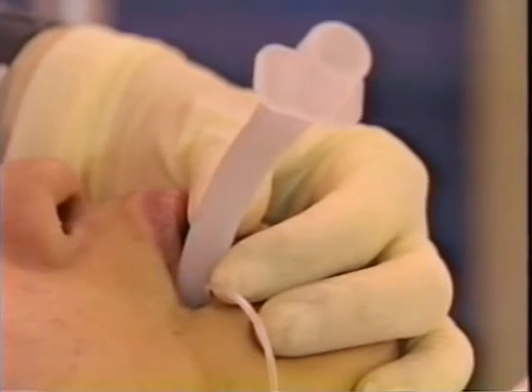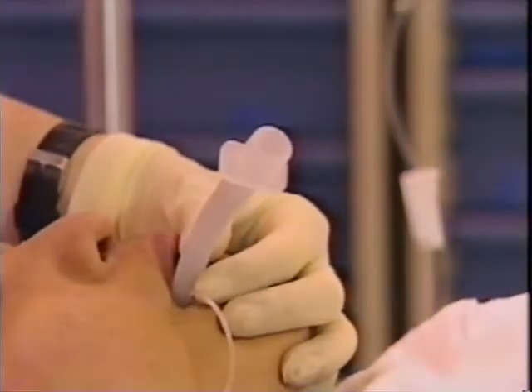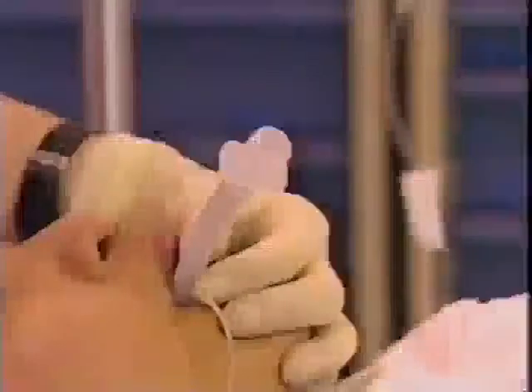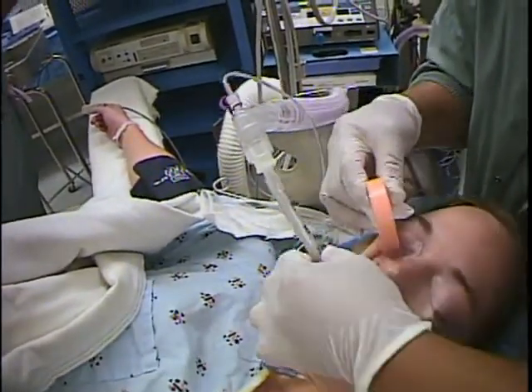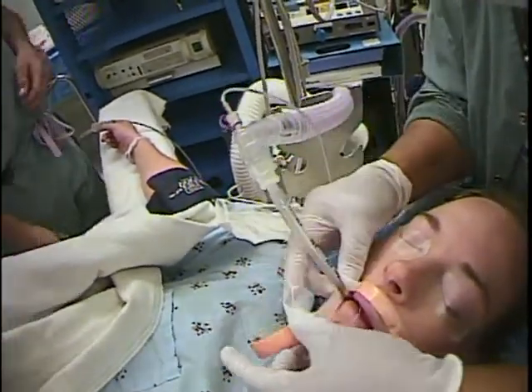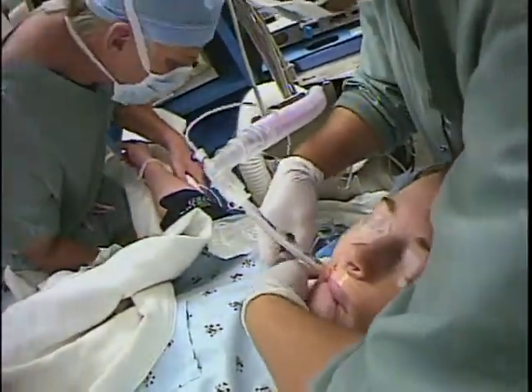After intubation, you need to stabilize the endotracheal tube before taping it, and also every time you move the patient. Hold the tube where it exits from the mouth, resting your hand on the cheek. Extubation is more likely if you hold the adapter end of the tube because it's less secure in the event of unexpected movement. Unless there's a need to place the tube midline, tape it towards the side of the mouth. It's more stable and comfortable for the patient, and suctioning the mouth is easier.